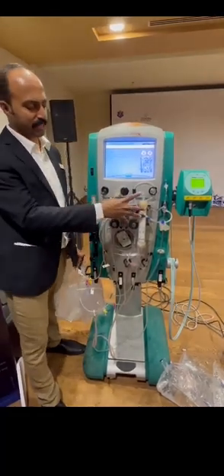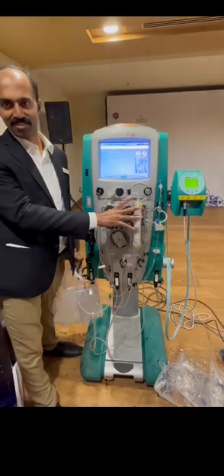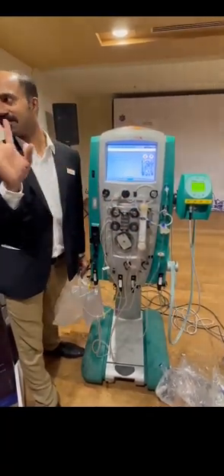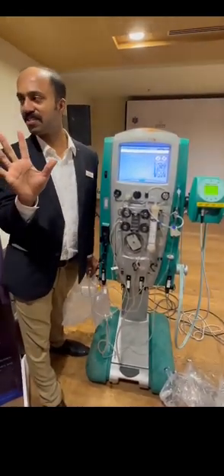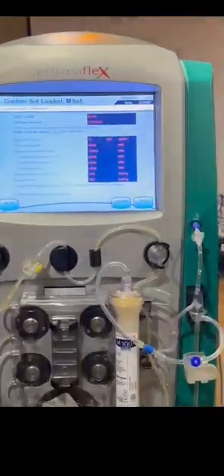Yes, this connection and all, now I explained, that's why I took this method. In 2 minutes, I will connect this. Okay, 2 minutes also I am not required. But the priming itself needs 6 minutes, compulsory. Then the test takes around 10 minutes. That 15 minutes is compulsory. Anyway, in 20 minutes we can connect it if we are experienced.